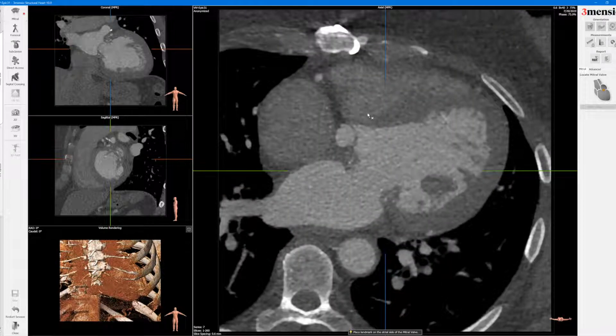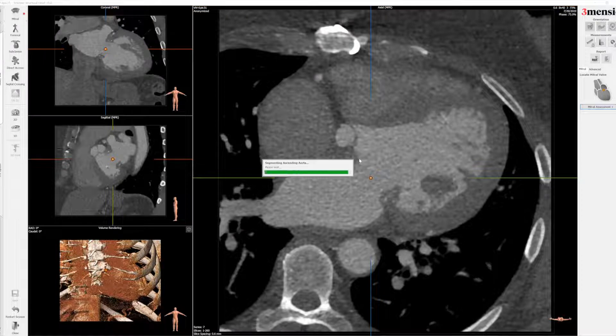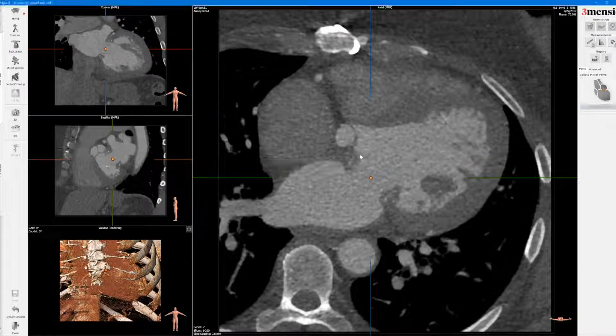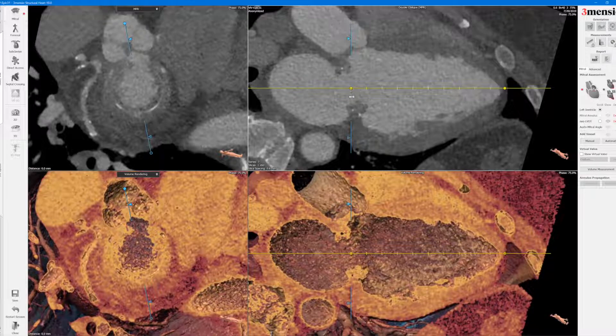First, with the mitral platform you click a dot on the cross of the prosthetic mitral valve and you click on the mitral assessment. Once you have that, you can see this view of the left ventricle — you have to make sure that this axis is actually extended to the LV apex and is crossing the prosthetic mitral valve.